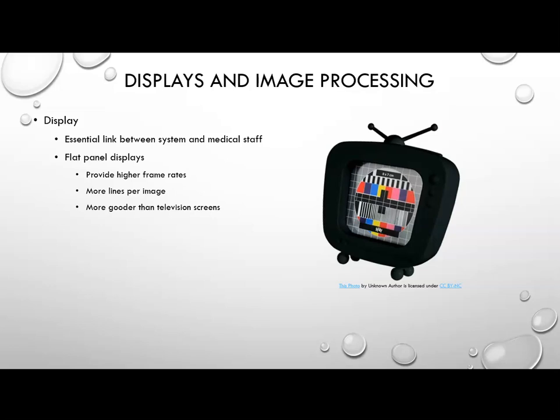The lines per image was about 512 lines per image, and that was standardized across the Western world at one point. Europe used a different system called the PAL system that was slightly different.